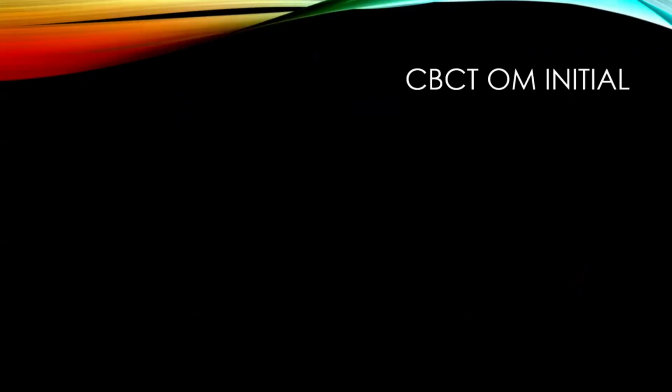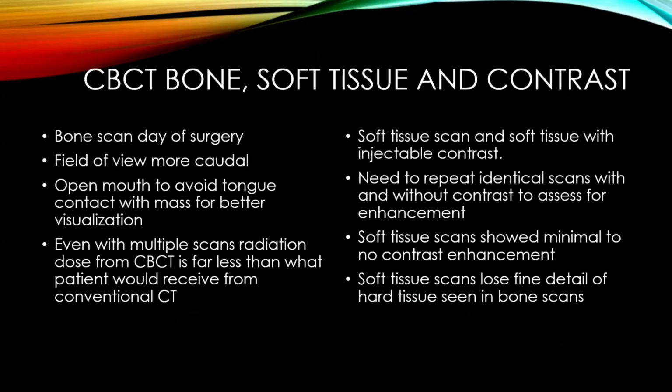And so let's switch back over here. So on the day of surgery, because again, 5 weeks had passed, we decided to repeat the bone scan to look at the bony margins, and also to change up the scan a little bit because the caudal portion of the palatine bone was a little bit suspicious as it heads towards the pterygoid bone. And that was right at the end of the field of view of the initial scan. So because we'd already fully evaluated all the other teeth and everything, on the day of surgery, we moved our field of view back.